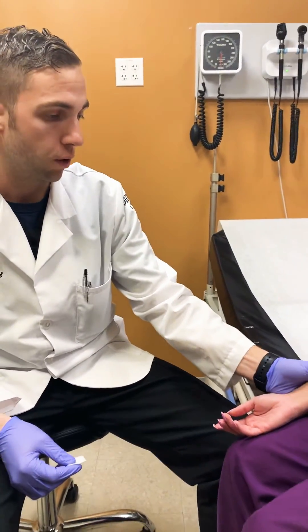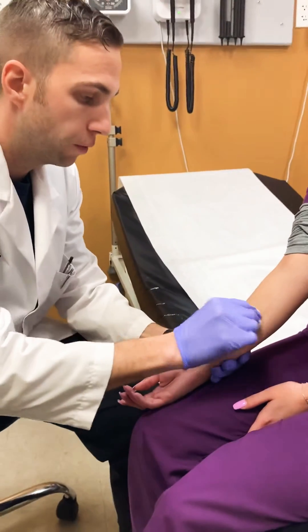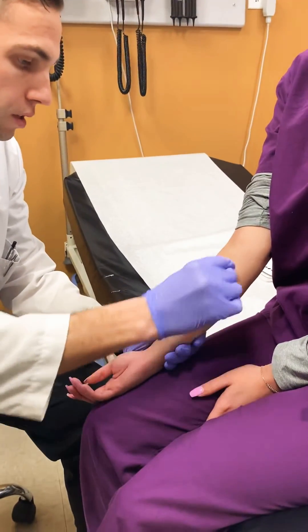It usually goes in the forearm — whichever forearm you prefer. You try to avoid tendons, veins, and those kinds of areas in the forearm, so make sure you clean the site before you do it. Use a circular motion and let that dry.